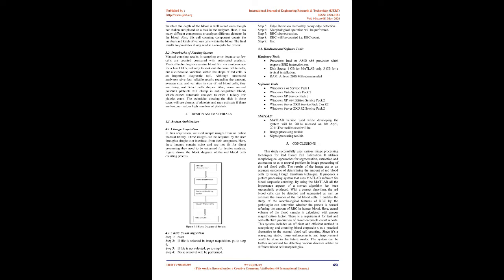3. Morphological image processing is a picture processing method that deals with recognition of an object, which is based on predefined criteria on their morphologies. Here, the acquired image has a dimension of 640 x 480 pixels, a 24-bit RGB JPG image. For simple image binarization, the RGB image has to be converted to a grayscale image.